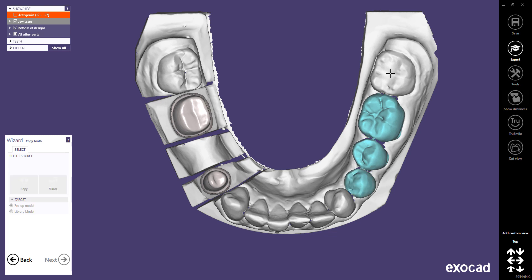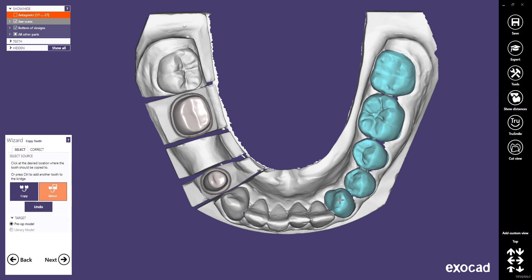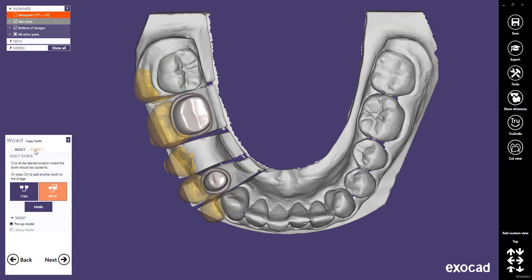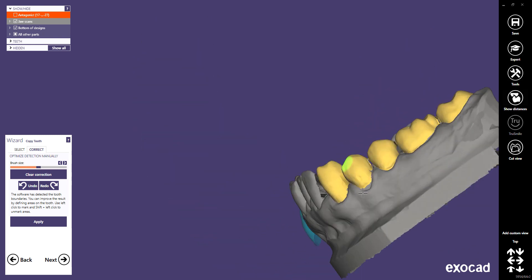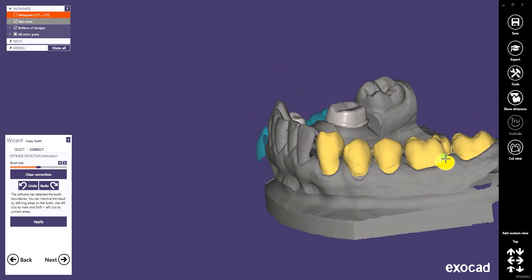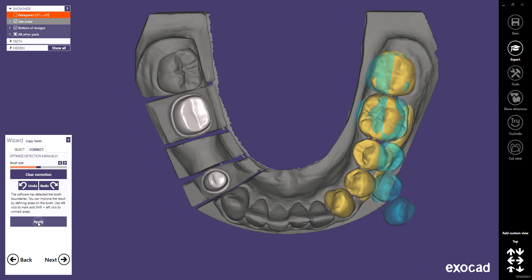You can also add adjacent teeth, which may help in placing the pre-op scan. You can perform corrections on a series of teeth, but only with the brush tool — changing the margin as in single tooth mirroring is not possible. You can use this brush function to add gingiva parts to your pre-op scan. Once finished, click Apply.